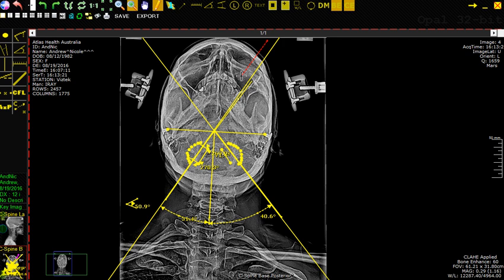The point of having this little line here is this represents the ideal entry point and the ideal feature that we're looking for on a person's face when we're going to be taking the x-ray. So in this case, we would look for, okay, this is going to correspond with the outside aspect of this person's eye socket and kind of going down through the middle part of their cheek through this sinus cavity right here. Now, we should probably do the same thing on the other side.